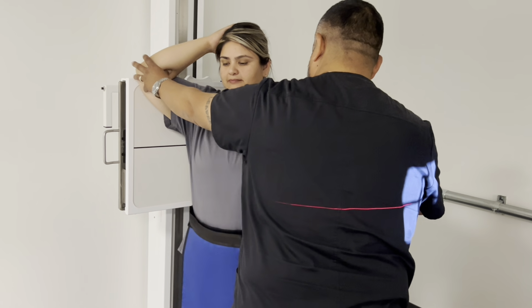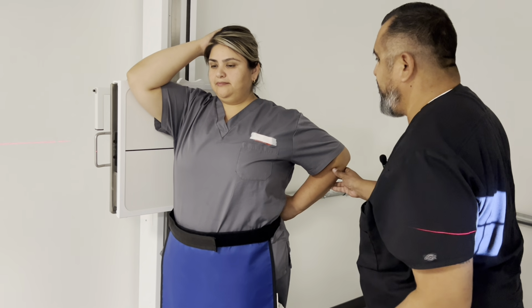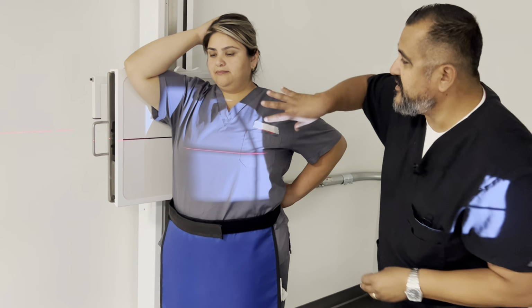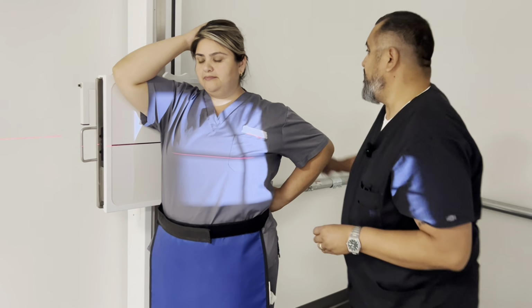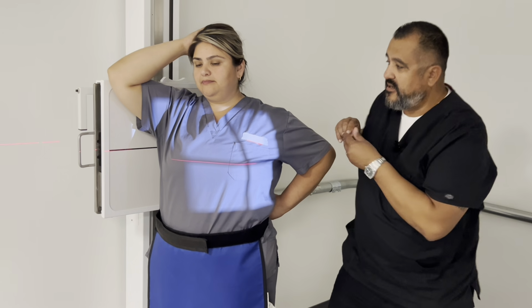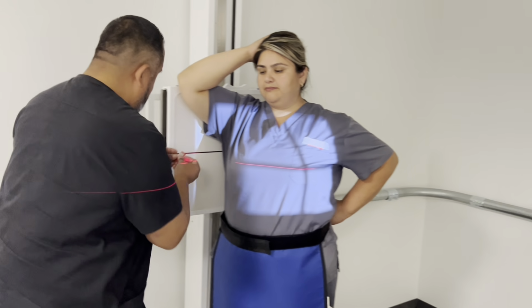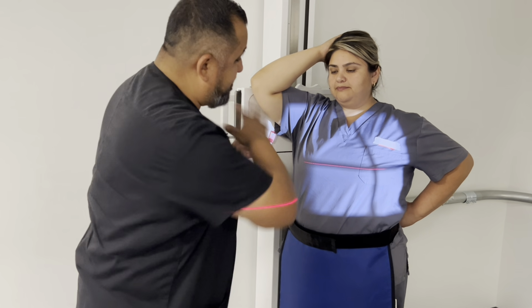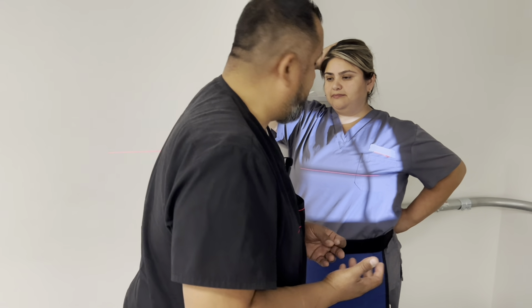Let's turn her this way, right there. There we go. 45 degrees. We're shooting through this elevated side to get to the side that's down. All right, so some people like to put their markers right over here in this area, like I was showing you on the previous one. You can put your marker there as well, so that way it's not in any anatomy. It's just the preference of your facility.